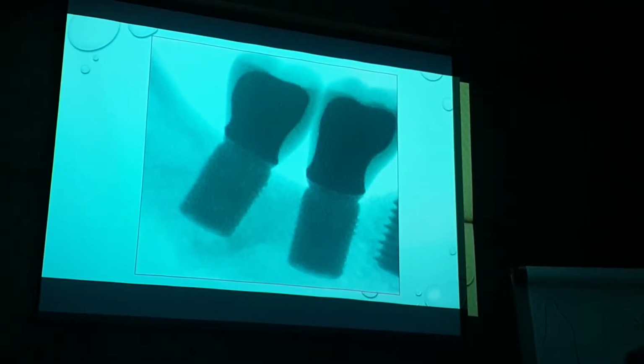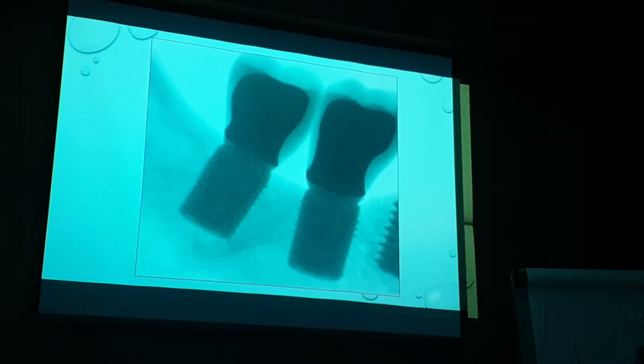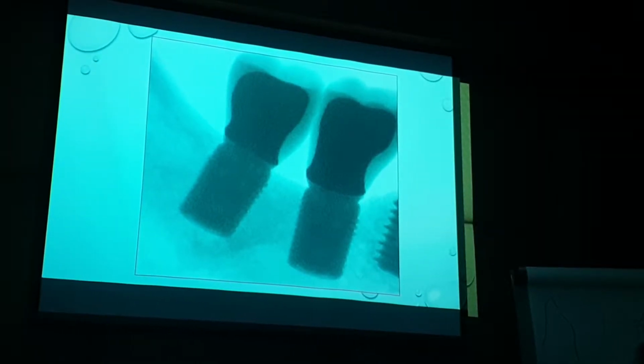And weren't we taught that grafted bone is of lower quality than host bone, vital bone? It's the opposite today. We can actually graft these sites and end up with better mineralization and better density in the grafted sites than host bone. Can we go in for immediate loading at this particular time? For sure. With this quality bone, absolutely. It's amazing, amazing stuff. You see that kind of mineralization.